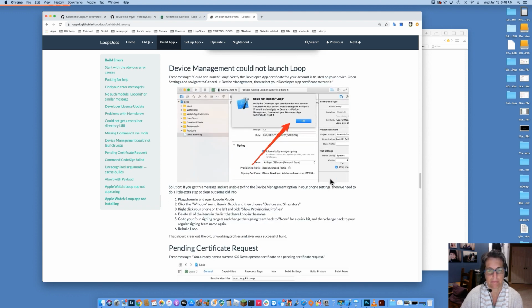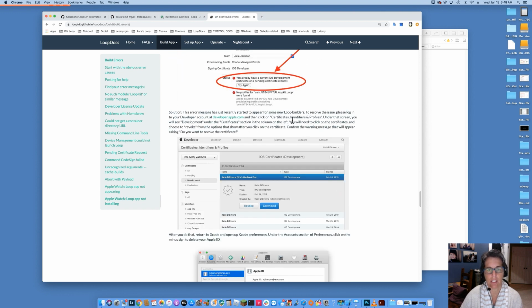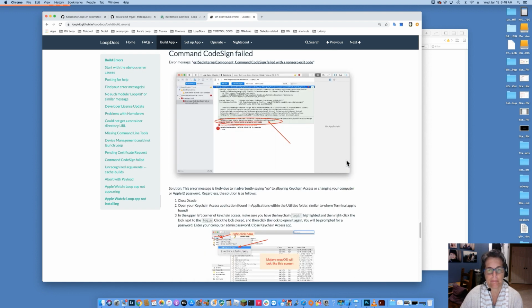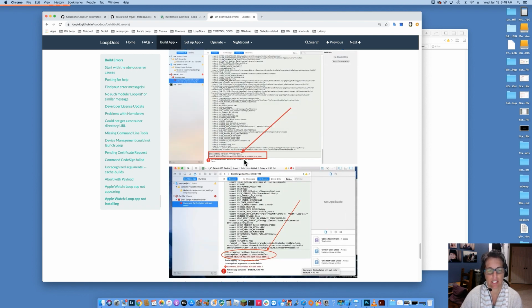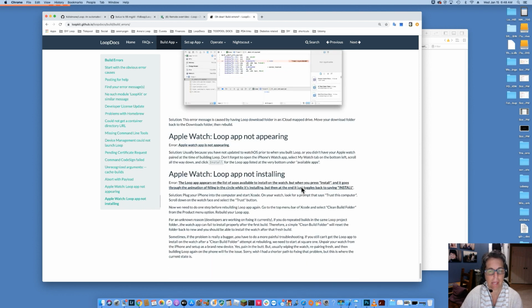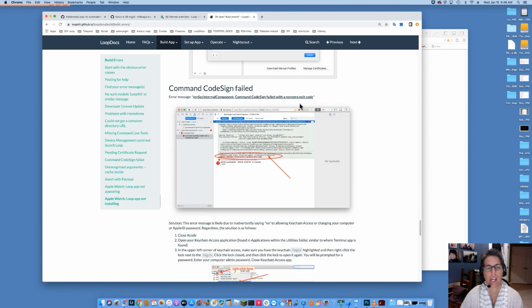So, device management could not launch. All of these things are in here. If you have a pending iOS development certificate, or an error in a security internal component, all of these things are listed in here. Look, unrecognized arguments, cache builds. Go ahead and check all of these things to make sure that you look at your error message, match it up here, and do it.